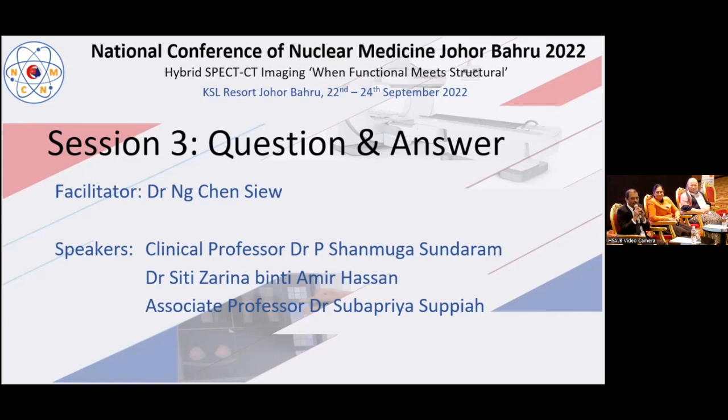So we believe in reporting this as PET findings and all diagnostic CT findings. So I strongly believe all patients, if they don't have any contraindications like allergy, and if they have good renal function, then I like to do as much as possible all initial patient studies as a contrast enhanced CT.